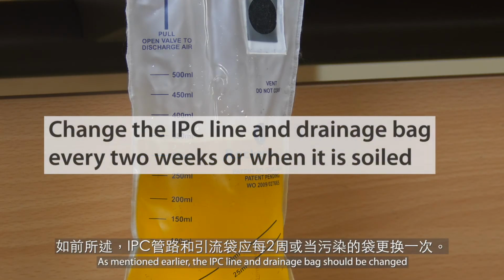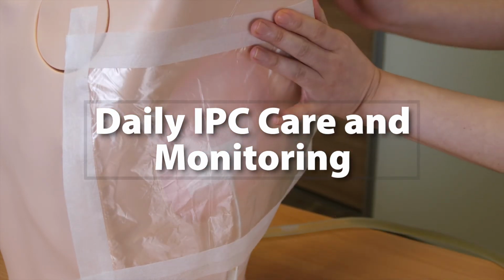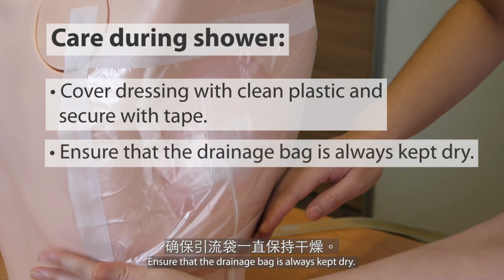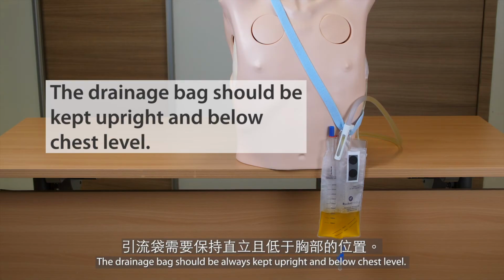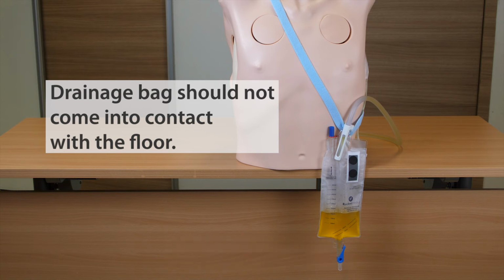As mentioned earlier, the IPC line and drainage bag should be changed every 2 weeks or when the bag is soiled. You may continue to shower with an IPC. When showering, cover the dressing with clean plastic and secure with tape. Ensure that the drainage bag is always kept dry. The drainage bag should always be kept upright and below chest level. To reduce the risk of infection, the drainage bag should not come into contact with the floor.